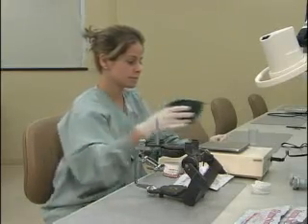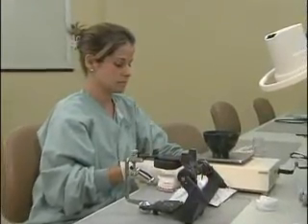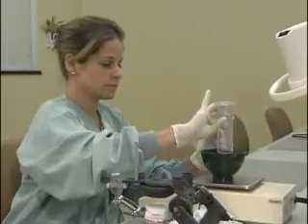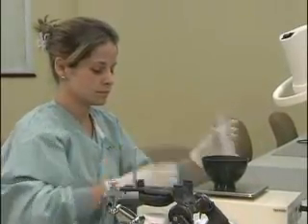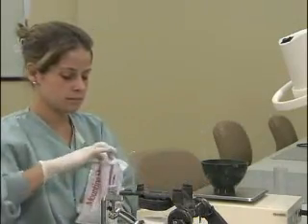Now we are ready to mix our mounting stone. Be sure you add powder to liquid. In this case, we have 52 milliliters of water, and we are going to add 200 grams of powder to that.